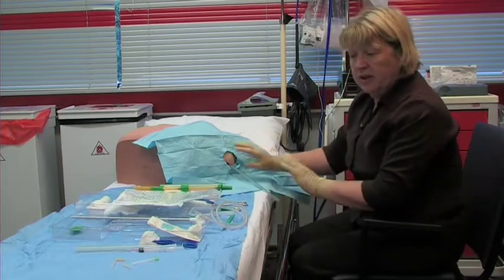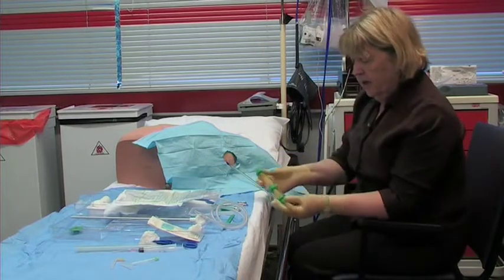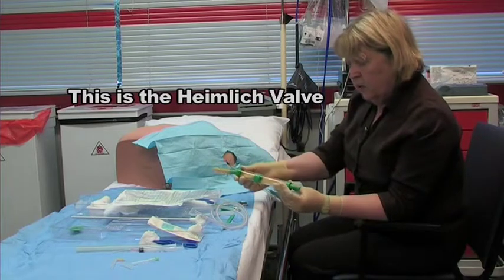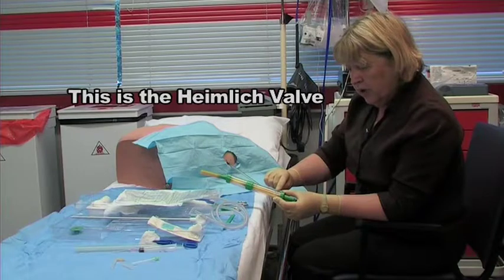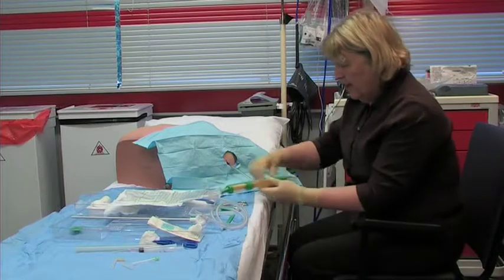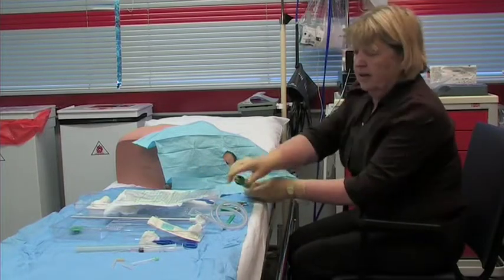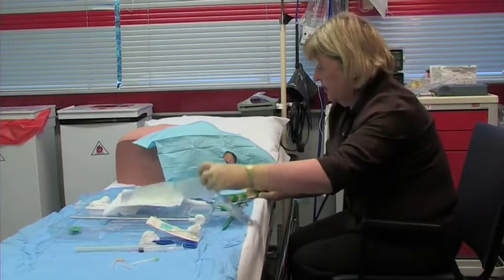We'll look at attaching the chest drain to the wall shortly. But firstly, if we have a look at how to attach a bag: this piece of equipment in the pack clearly shows which side attaches to the lung side and which attaches to the bag side. So, insert this side into the lung side and the bag to the other side.